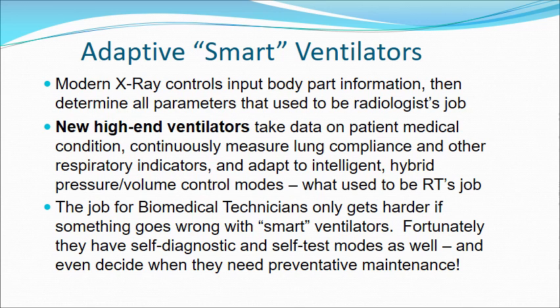In fact, I spoke with a younger RT, and when I asked whether or not the machine was in pressure or volume mode, she wasn't even aware of what that meant because she'd been trained on these new intelligent machines. So the job for biomedical technicians only gets harder if something goes wrong with smart ventilators. Fortunately, they also have self-diagnostic and self-test modes, and even decide when they need preventative maintenance.